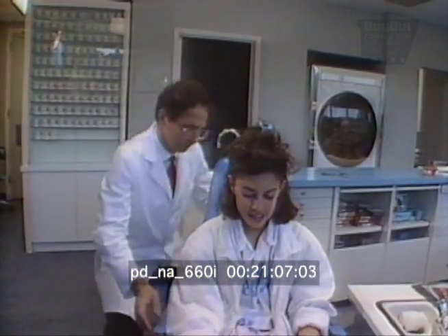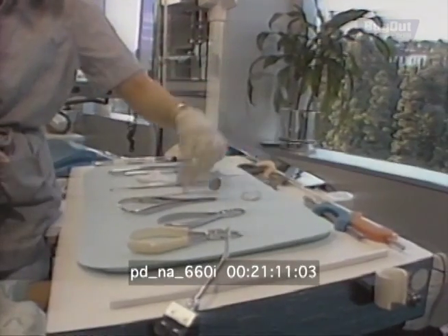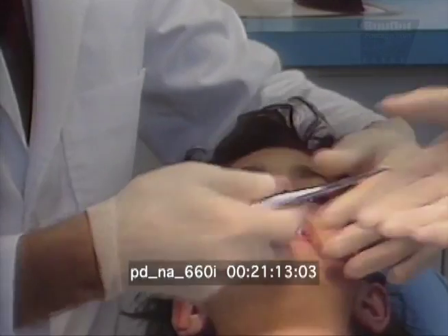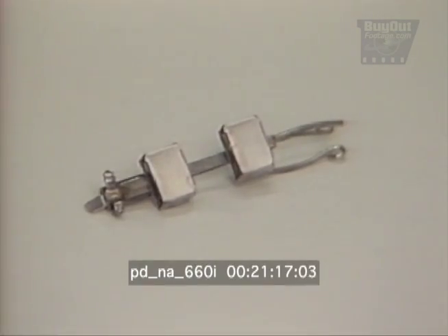Many people need braces to move the large back teeth called molars, but this is often the slowest, most difficult step. Now orthodontists are moving these teeth more quickly with the help of two small magnets that push against each other.